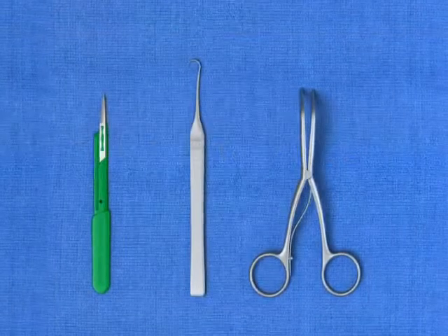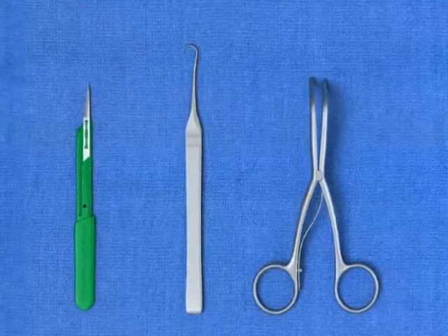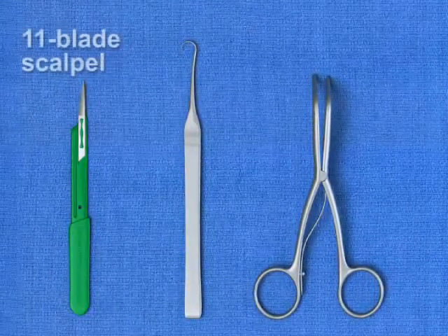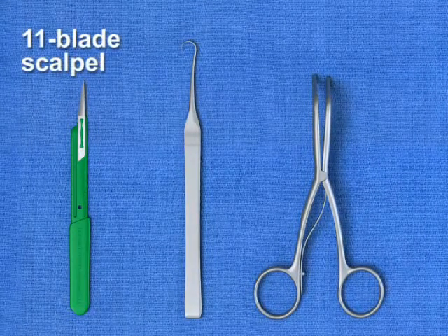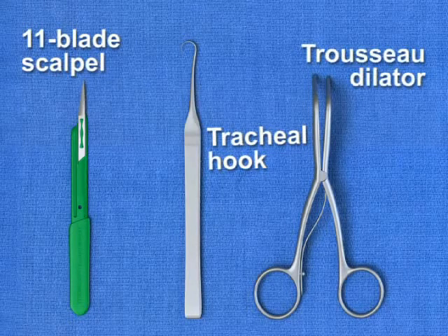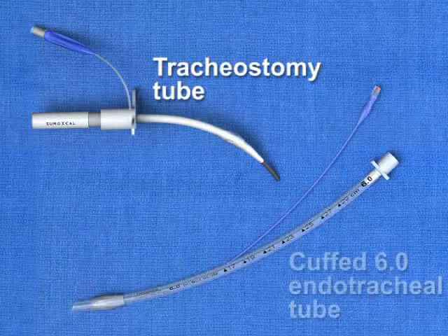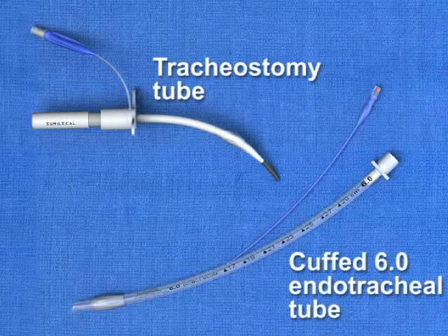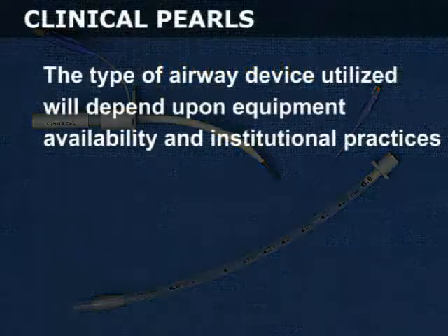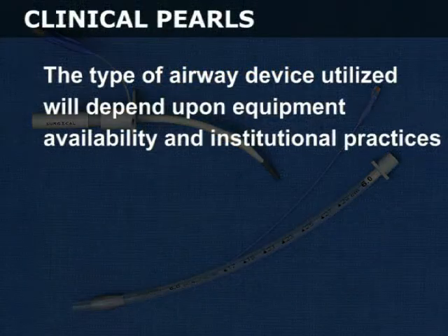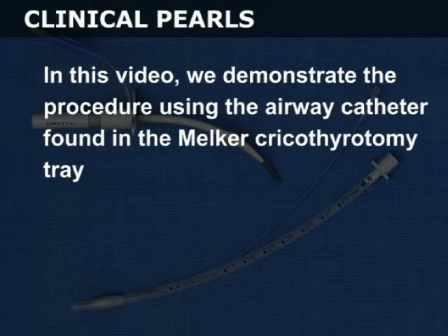The required equipment for a traditional surgical cricothyroidotomy includes an 11-blade scalpel, a tracheal hook, a trousseau dilator, and a tracheostomy tube or cuffed 6.0 endotracheal tube. The type of airway device utilized will depend on equipment availability and institutional practices. In this video, we demonstrate the procedure using the airway catheter found in the Melker cricothyroidotomy tray.